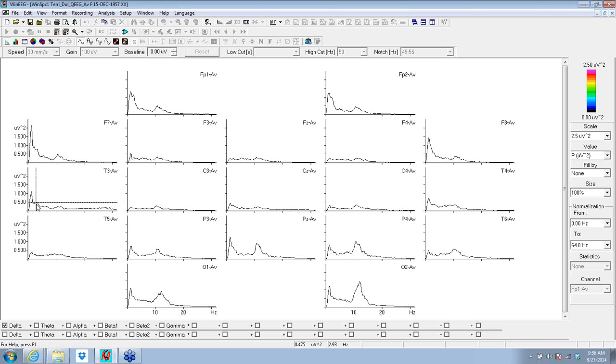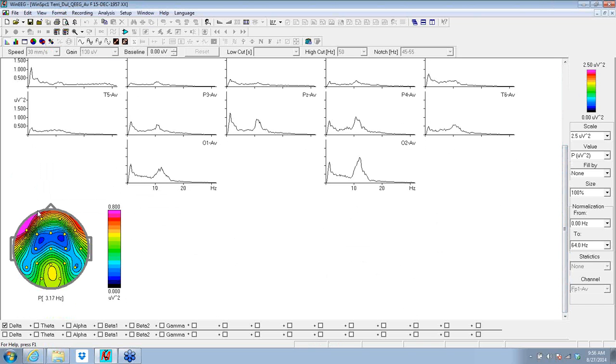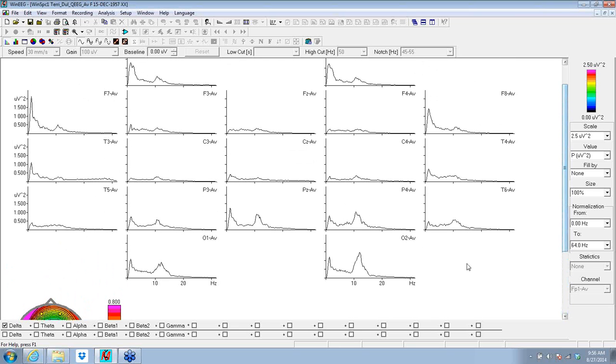Now, it doesn't mean that there isn't something going on that may end up causing some changes here. And the slower content that was present here on the left would be in the word finding, verbal fluency area. And so there may be some changes due to vascular change. But Alzheimer's as a process would be slowing the alpha into the theta frequency band and not be this fast. So this does not look like Alzheimer's. It does look like we may have an issue with respect to vascular sufficiency and maybe a vascular related dementia change over here.